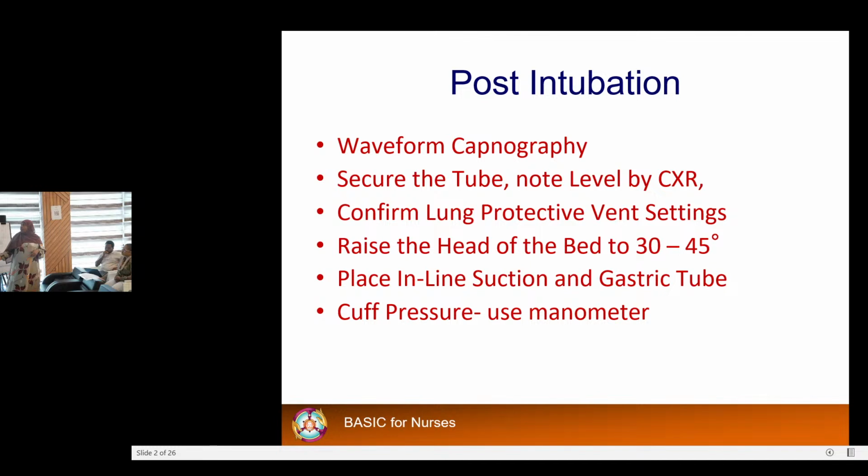Now, if you decide to put your patient on the vent, what are the key lung protective vent settings, which we discussed yesterday with Dr. Naima? Important settings in your vent. Yes, you know them. Tidal volume should be. Next. PEEP should be in a range.